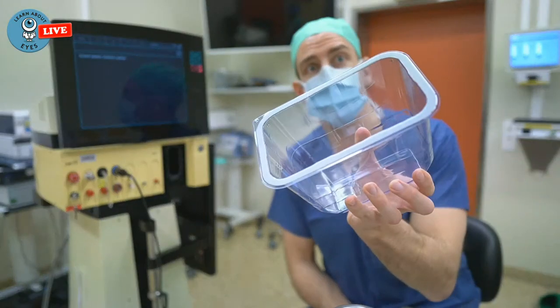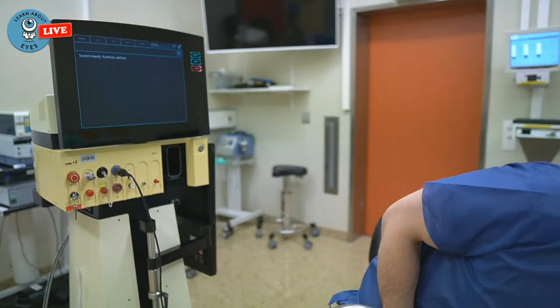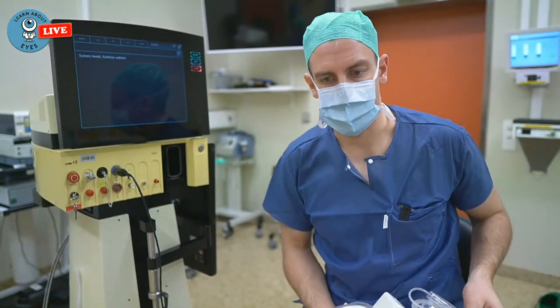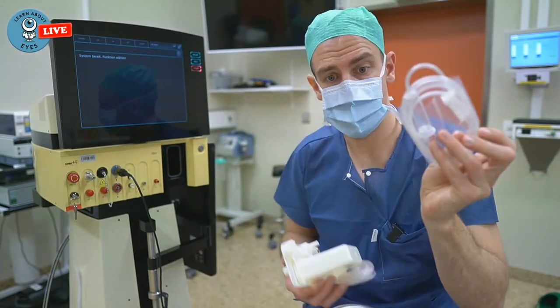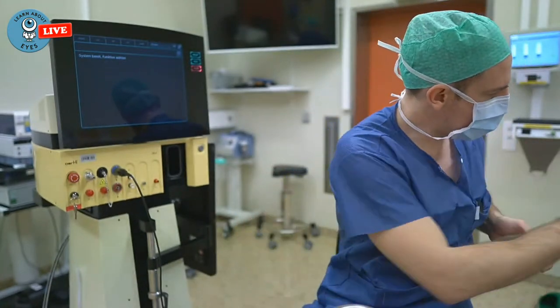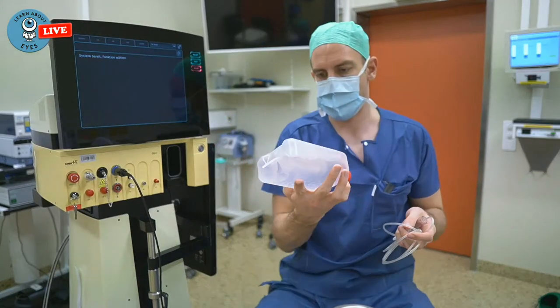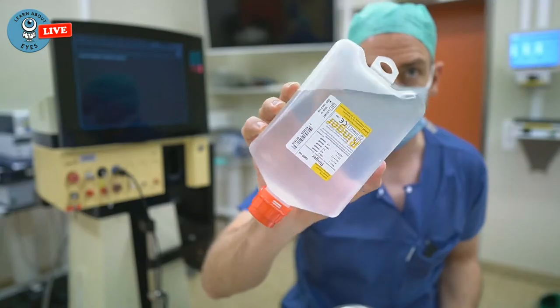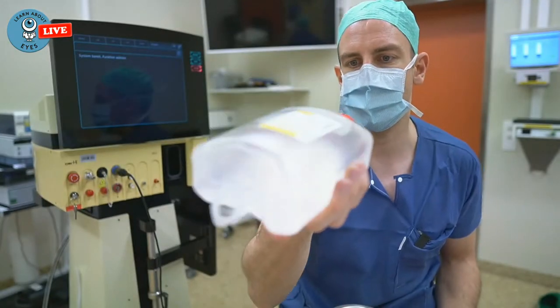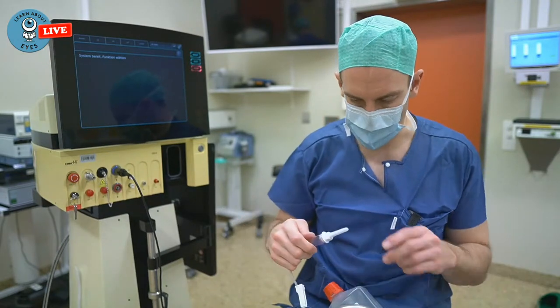Okay, I'm gonna keep this because I'm going to drain the fluid into this and put this over, and let all the fluid go in there. Usually you would be putting this into your BSS. Now, I'm just buying like 3-4 Swiss francs worth of, this is called Ringerlaktat, I don't know, it's just a saline solution and it's really cheap. You can get it at any pharmacy.